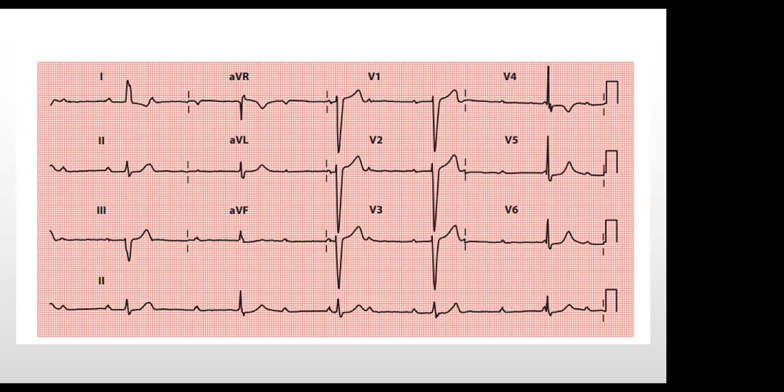Dr. Augustine. I'm still taking a look at it, sir. You are still looking at it. Okay, please do look at it. Yes, sir. Anyone, once you've had enough look, you can take the stage and tell us something. The good thing is that on exam day, you won't wait for anyone, you do it anyway. So just get used to it.